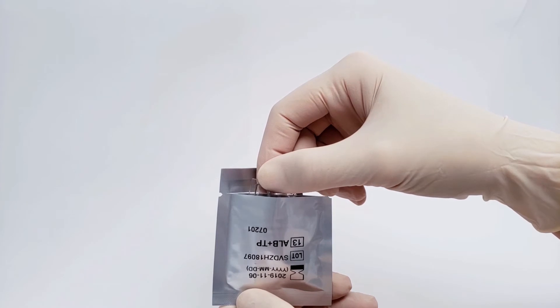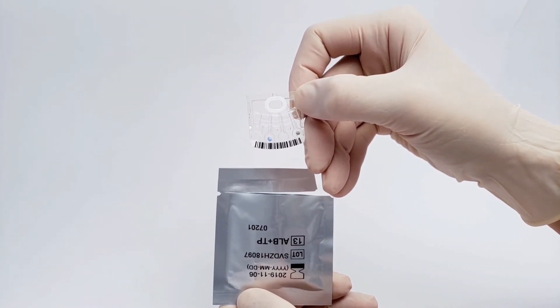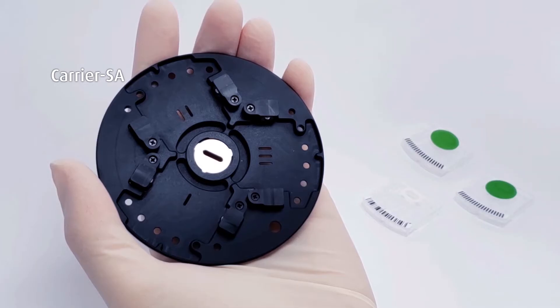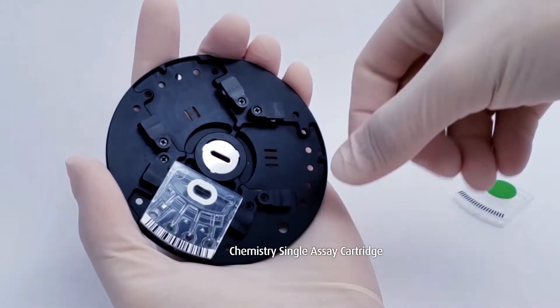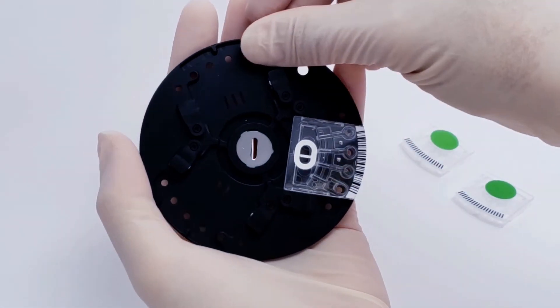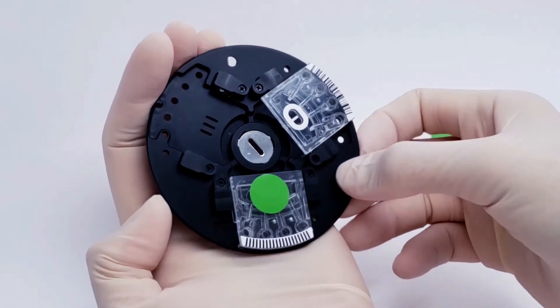Step one: tear the foil pouch and take out the chemistry single assay cartridge. Hold the edge of the single assay cartridge to avoid contaminating the optical detecting area. Then put the cartridge and balancer onto the carrier assay. Three cartridges are required to be loaded on one carrier assay. Place balancers onto the other unused slots.